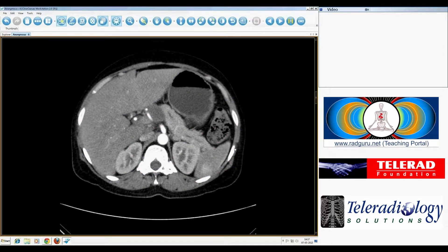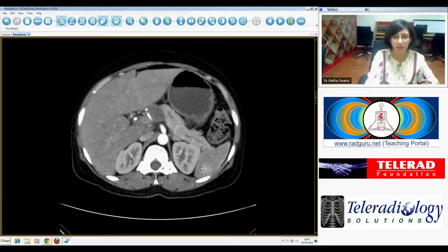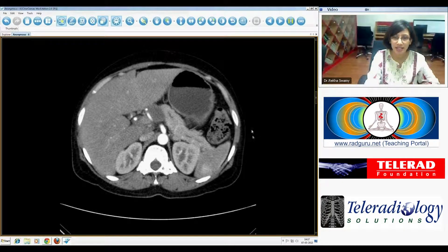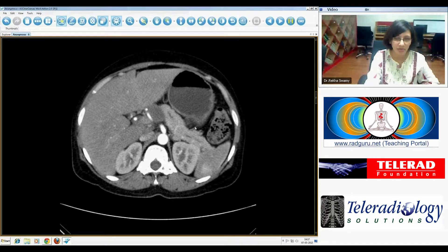Good afternoon, everyone. This is a case of a young woman who presented with abdominal pain. These are axial CT scans through the abdomen and pelvis in an arterial phase.